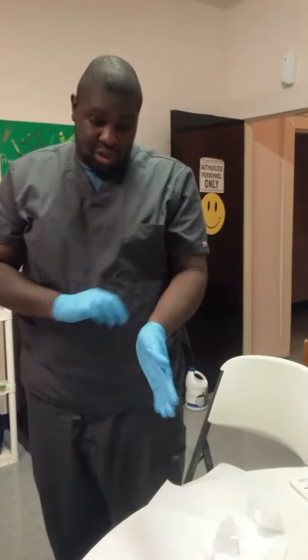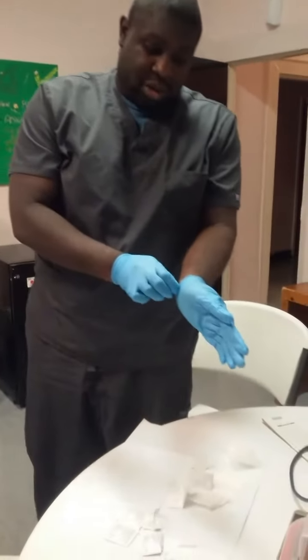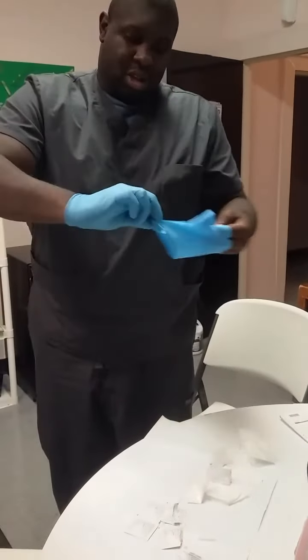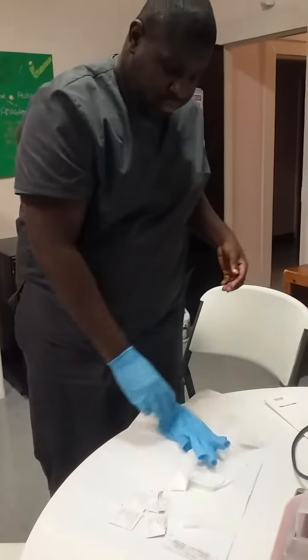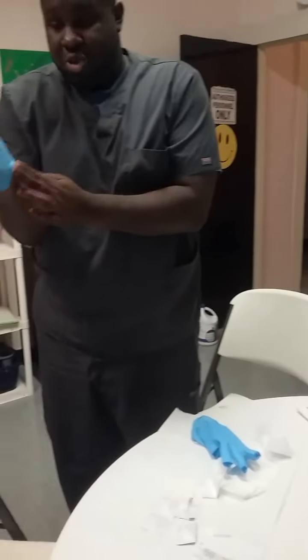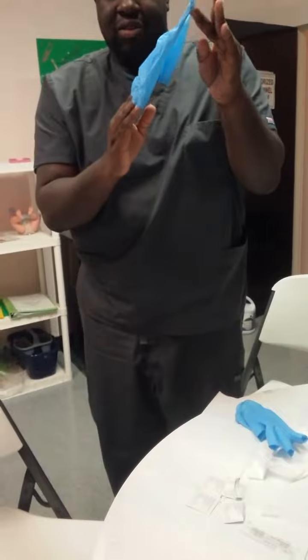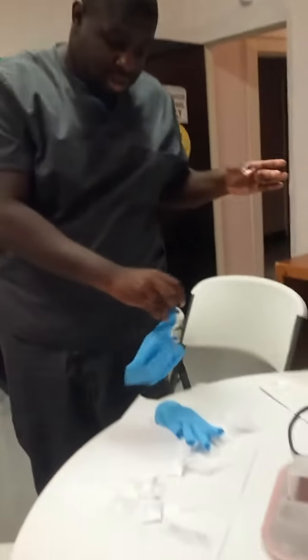After we dispose of it, we remove our gloves. The key is to never touch the part of the glove that you used for the procedure, and that's pretty much it. That's how to do the bleeding time test.